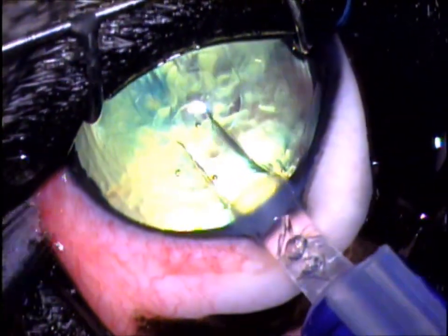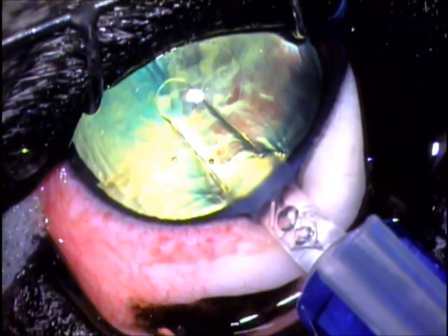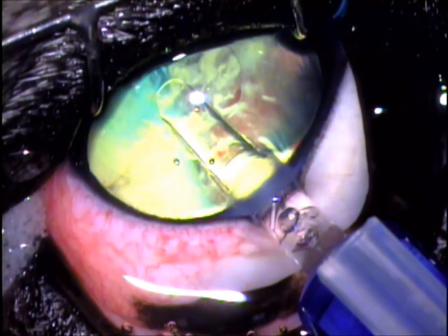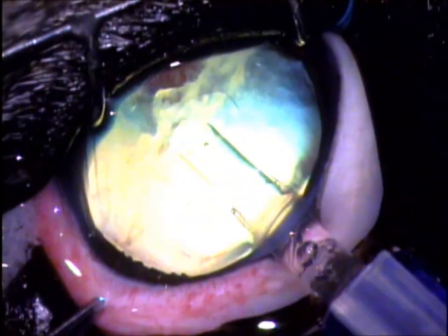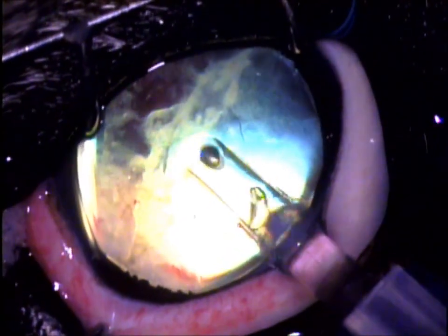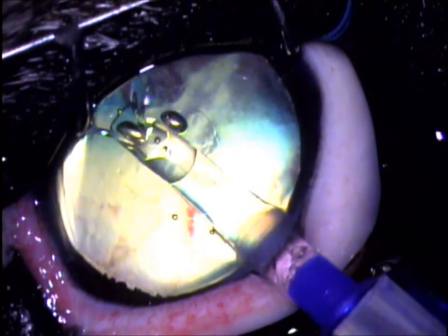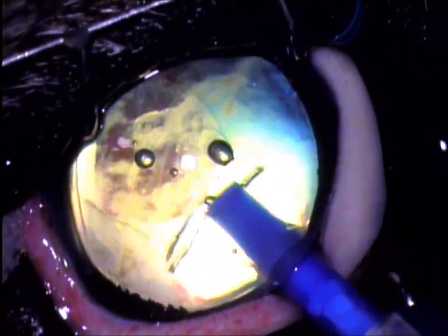This is the intraocular lens, and we're injecting it in through the small incision — that three millimeter incision. This lens will unfold into the eye, and it provides a much better focusing ability. Not all surgeries can take a lens, and those animals in dogs still tend to do very well. But if possible, I always try to put in a lens.